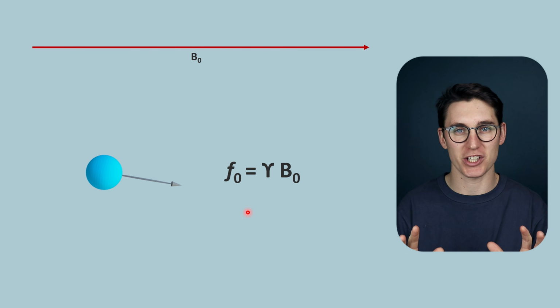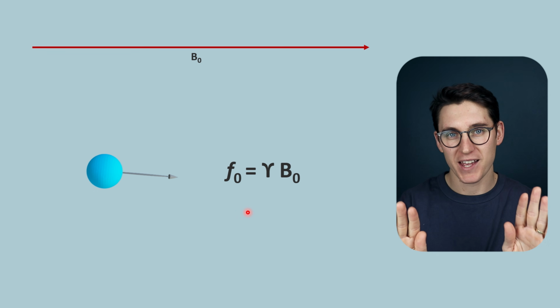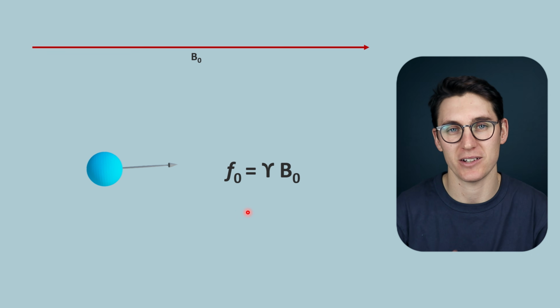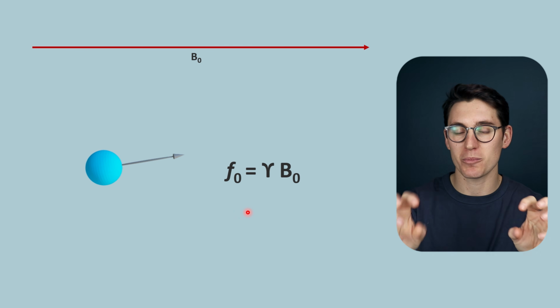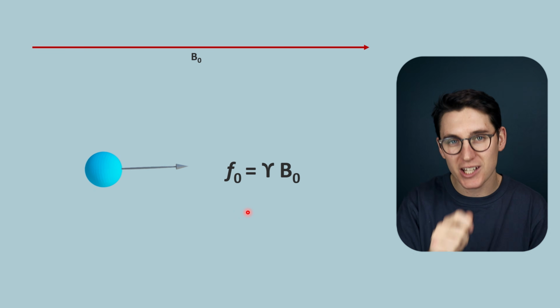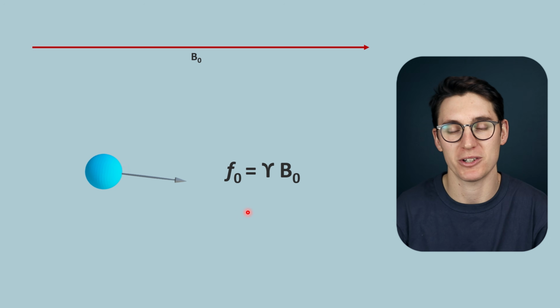Now in MRI imaging, we are generally comparing signal from fat and water. And it's the differences in signal between fat and water that give us contrast within our image. Now the hydrogen atoms in fat, as opposed to the hydrogen atoms in water, exist in very different molecular structures, and it turns out the local environments mean that there's a difference in this precessional frequency, and it's that difference that we term chemical shift.